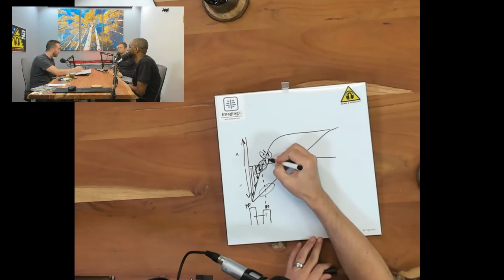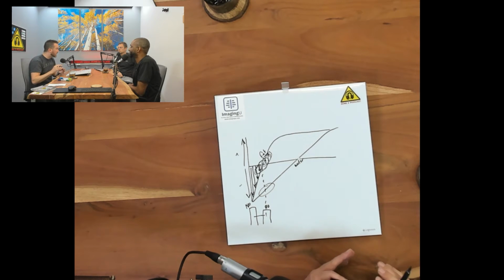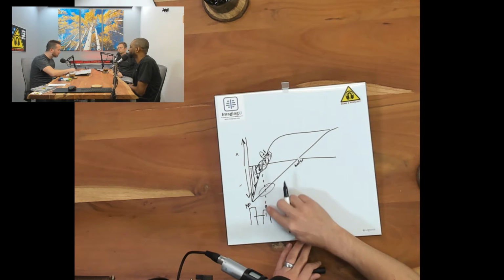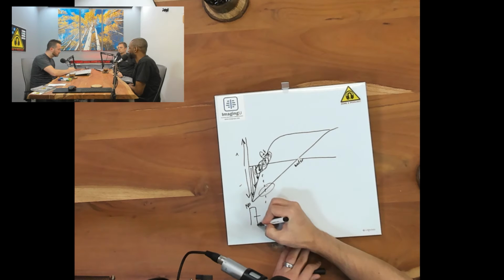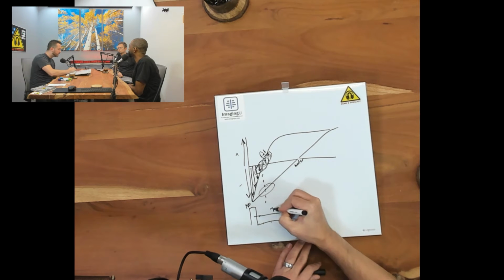Mm-hmm. Another thing I find in MSK is that we have a lot of rads that say, I don't like a STIR because the bone and fat are so dark. And I would tell them to change their inversion time to where there is a little bit of fat playing the game, so it's more gray instead of black. In this case we just did a STIR, but the main difference if we were doing a FLAIR is just a longer TI time.